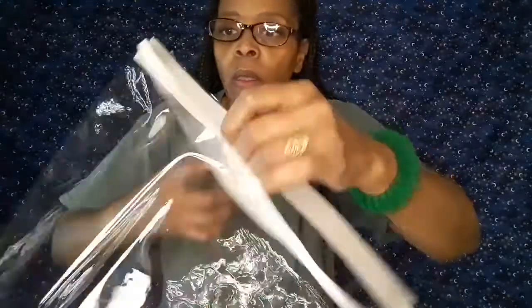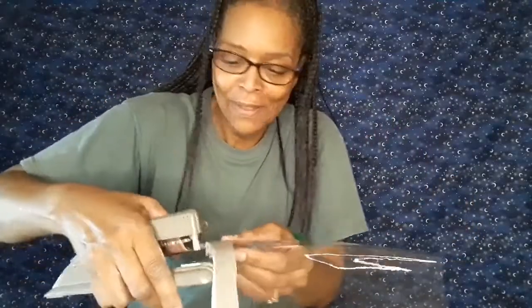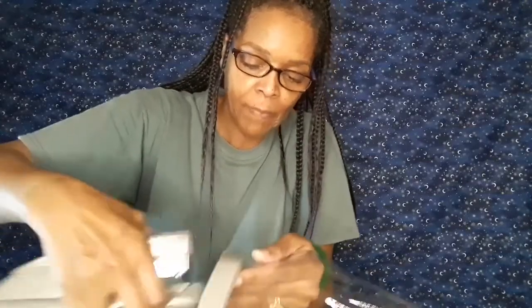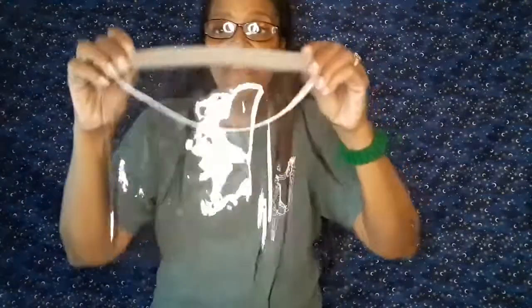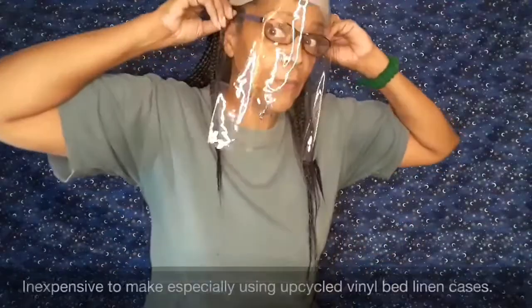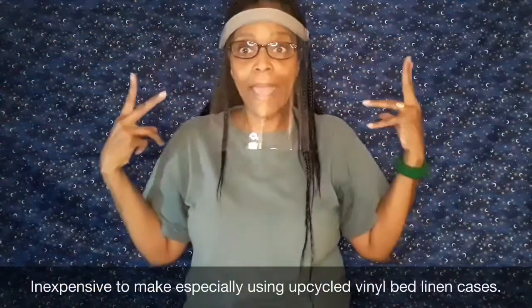You know what I mean? All right, so I'm going to staple. Oh my goodness. What a day. I'm going to staple, and I'm going to staple one more time. And that is your very quick, handy dandy face shield. And I'll try it on. It comes around. I mean, it's going to block anything coming at me.